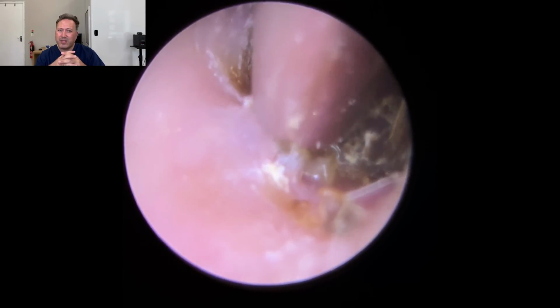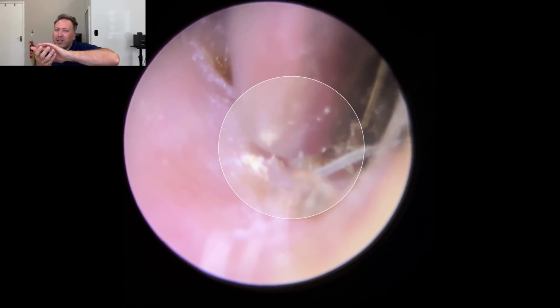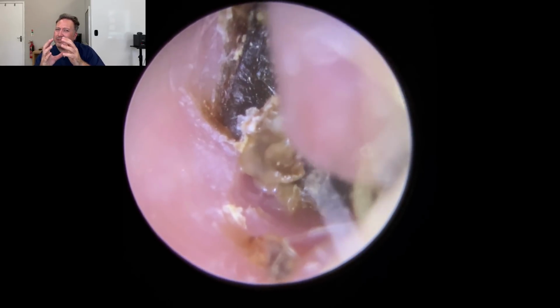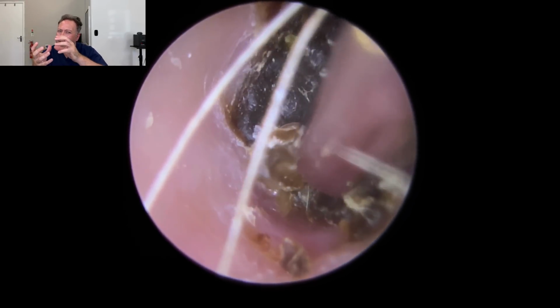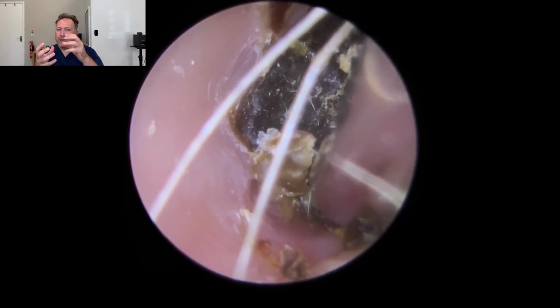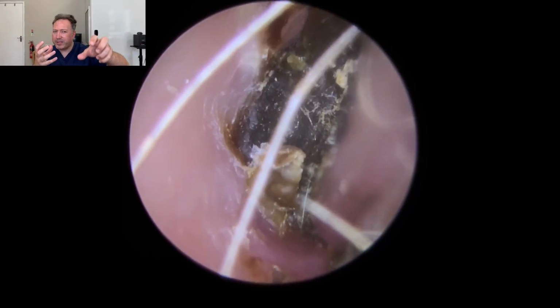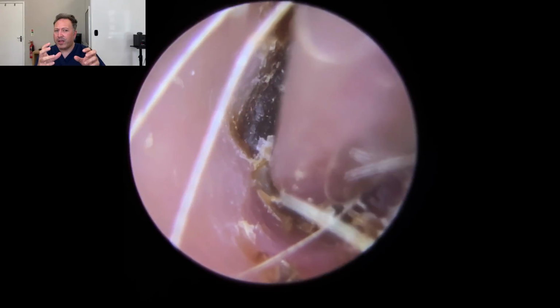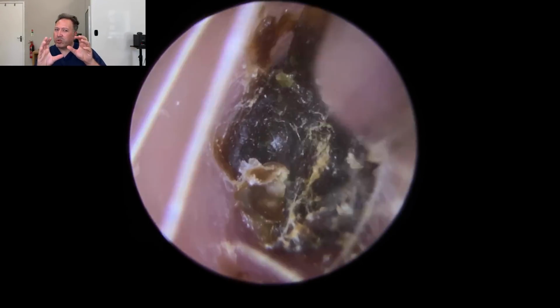You can see that as we lift here, look at the difference, that section there. Look how wet that is. Now that's usually a little bit disconcerting, because if you see this sort of really dry wax like this and this very wet liquid type wax underneath, that would indicate to me that there is fluid trapped behind this wax. Okay, now given this patient's history of eardrum repair and tympanoplasty, you always wonder what's going on behind here, especially the Q-tip's been pushed in that deep.